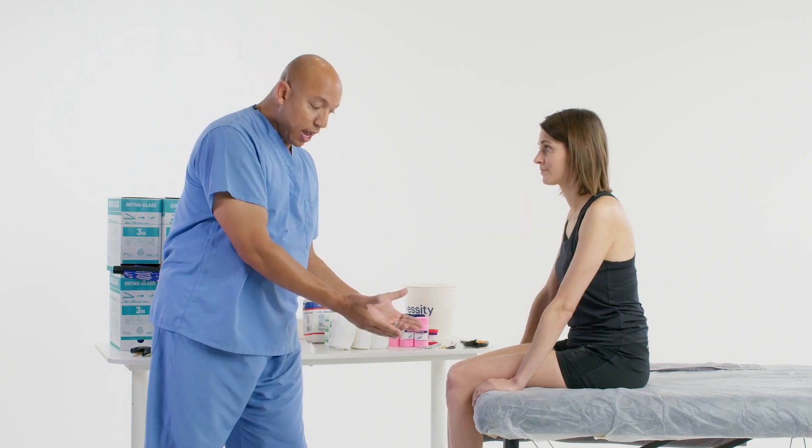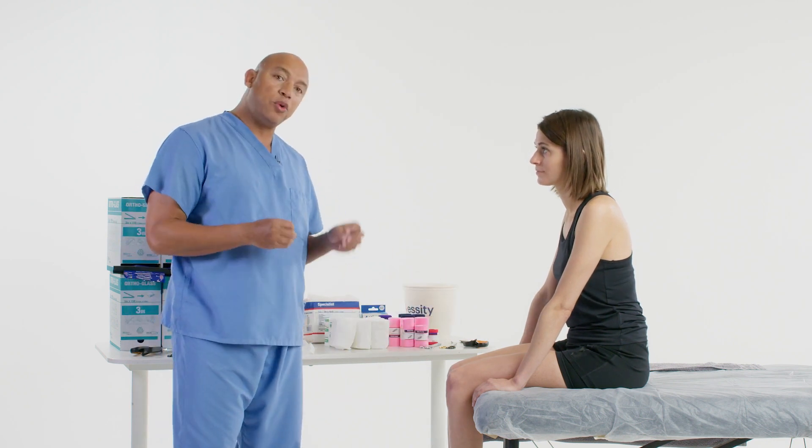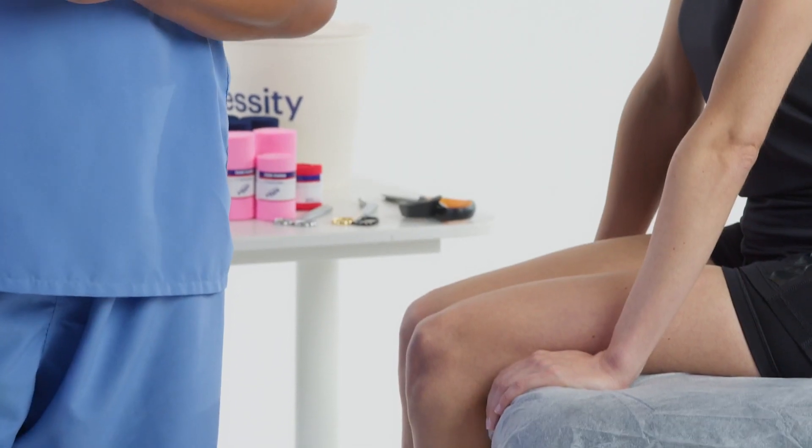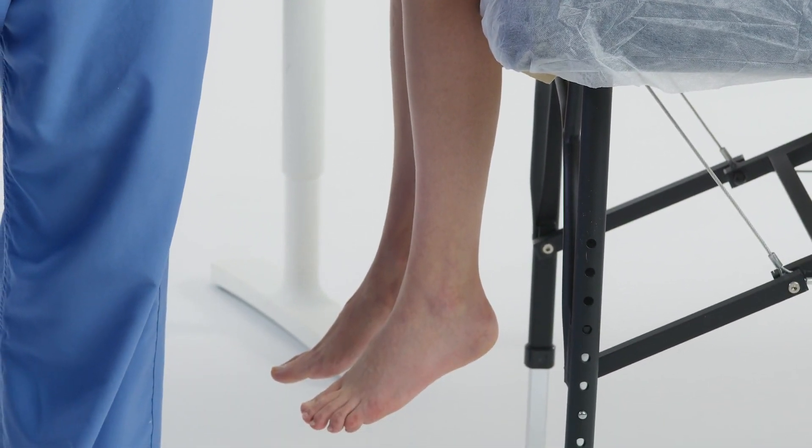The position is going to be determined by the physician, but you do not want to put that patient in a 90 degree angle or neutral position in those cases. Now let's talk about three positions we're going to get the patient in. One position is to have the patient seated, and remember the patient is already swollen so they're going to have pooling of fluid going distally. You need to do that expeditiously. The seated position is going to be a little bit harder to apply because gravity will be working against us.